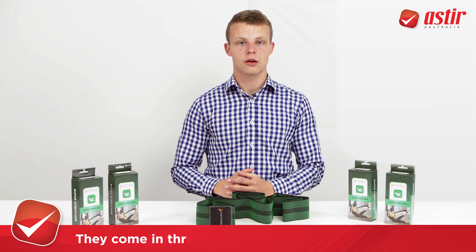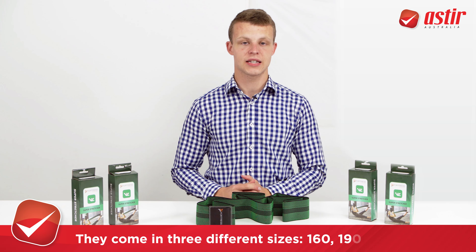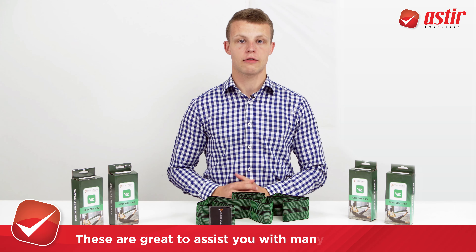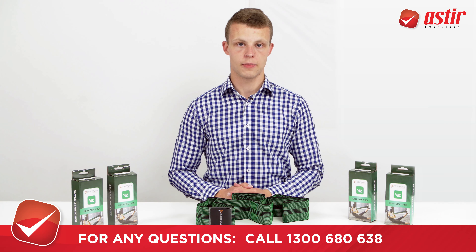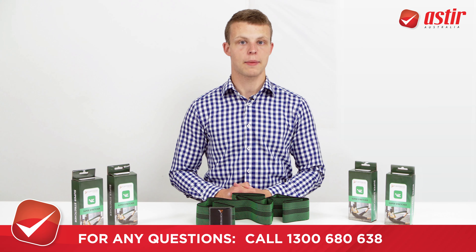They come in three different sizes: small, medium and large at 160, 190 and 230 centimeters. These are great for assisting you with many stretching exercises. If you have any questions or want more information about these awesome products, give us a shout and we're happy to help.